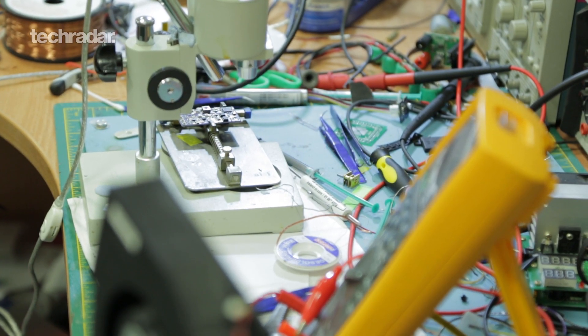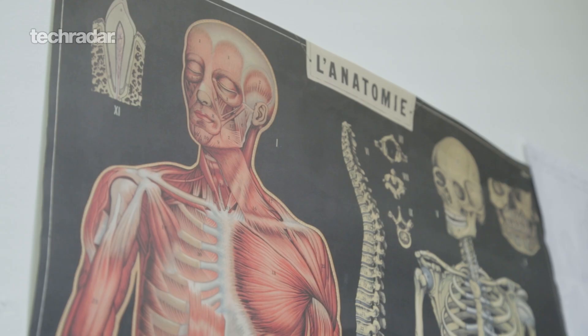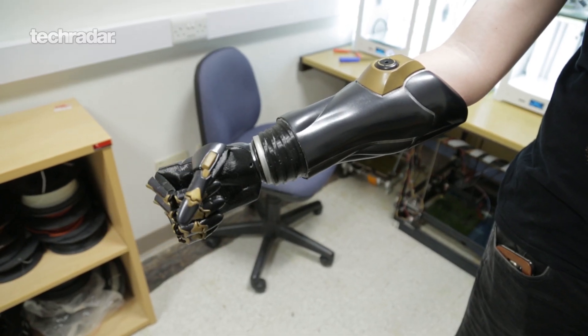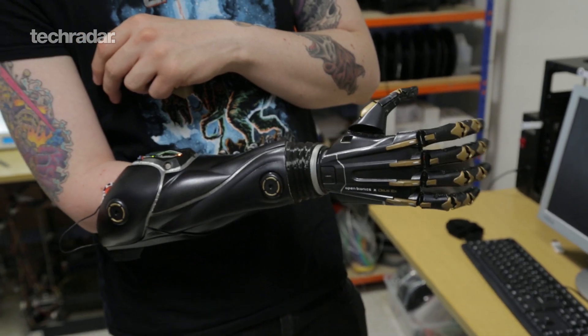What's really cool about this technology is that we can radically change the fitting process for prosthetics. At the moment there are multiple consultations and it can take months before somebody actually gets their prosthetic. Somebody could order a prosthetic on a Monday and receive it on the Friday without ever meeting with us — and that's huge for kids who are in school and don't want to be taken out of school.